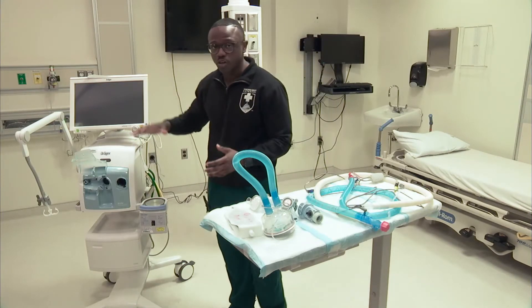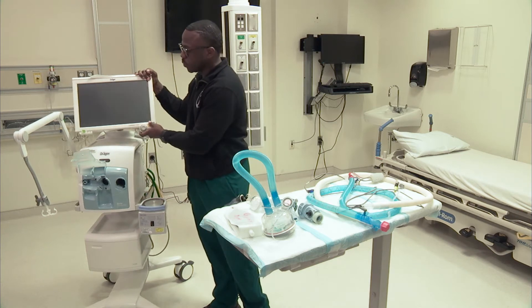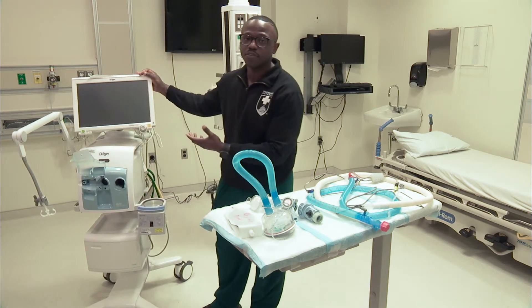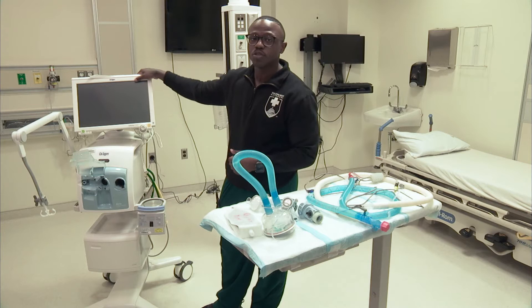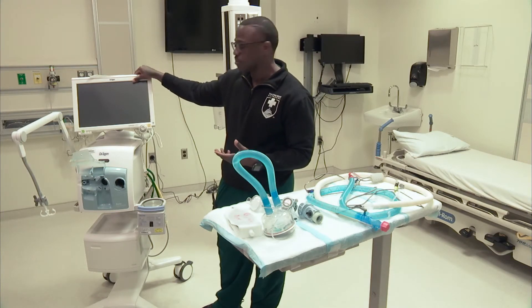To begin with, I'm just going to talk about the outside of the machine. This top portion right here, this is what we call the provider interface. At this point, you'd be able to set your parameters, place your settings, and you'll also be able to review your measurements.